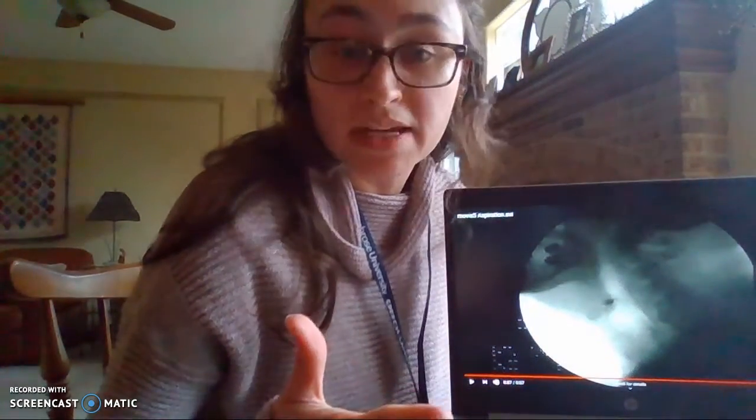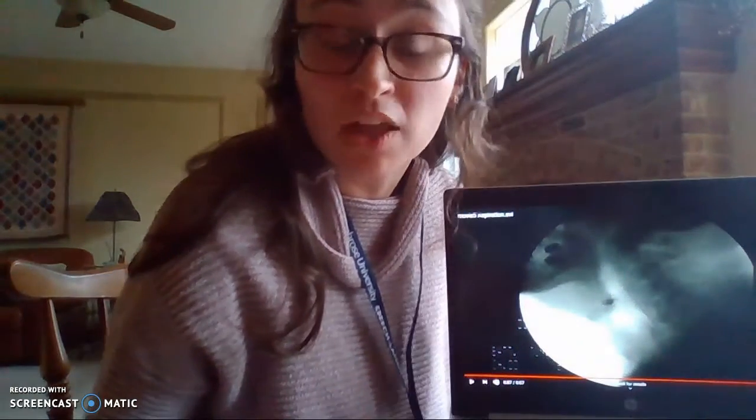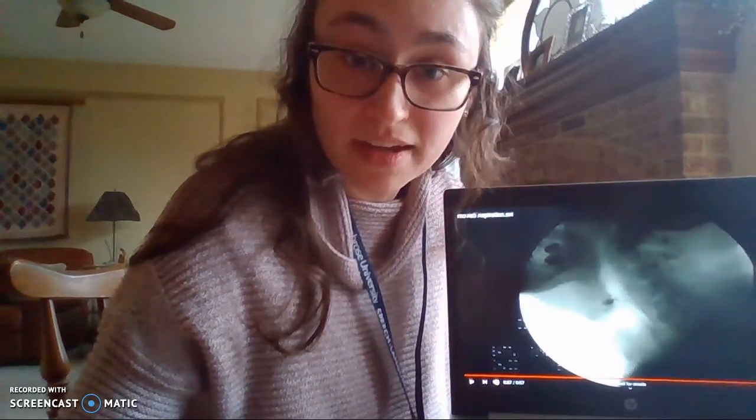So I'm thinking maybe for liquids, we'll go a little thicker since this was a thin liquid, and maybe I'll have you swallow twice to clear that residue that's left after the first swallow. I'll have you take a second swallow, and that cleared up the vallecula a little bit.